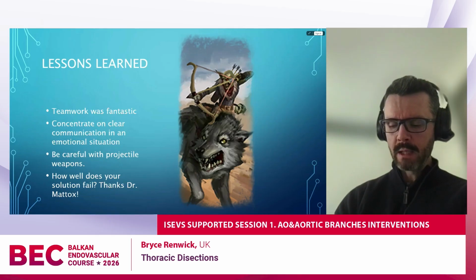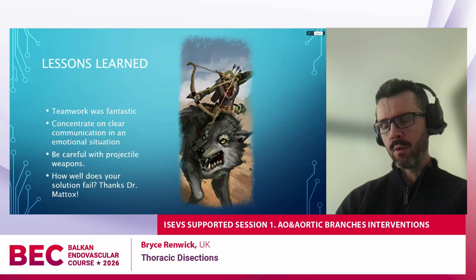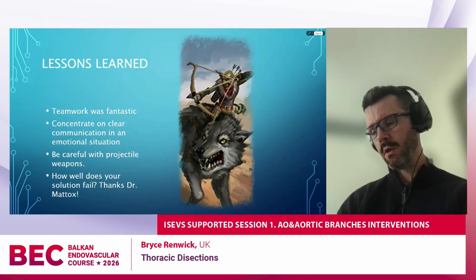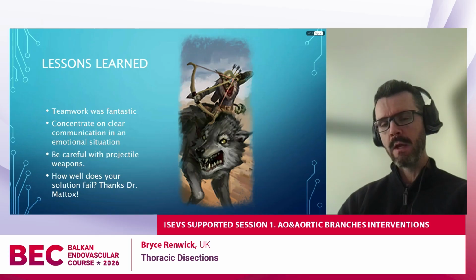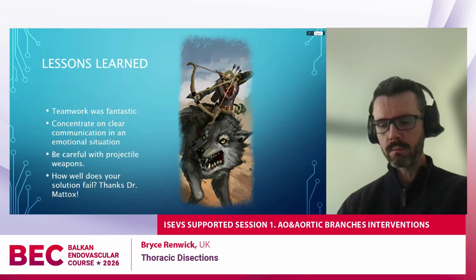And when I was planning and looking at this case, I remembered the traumatology teaching from Dr. Mattox's book, which says, when you're looking at a difficult trauma situation, think about how well does your solution fail and what position will you and your patient be in, which is why I thought the thoracic stent was a good idea.